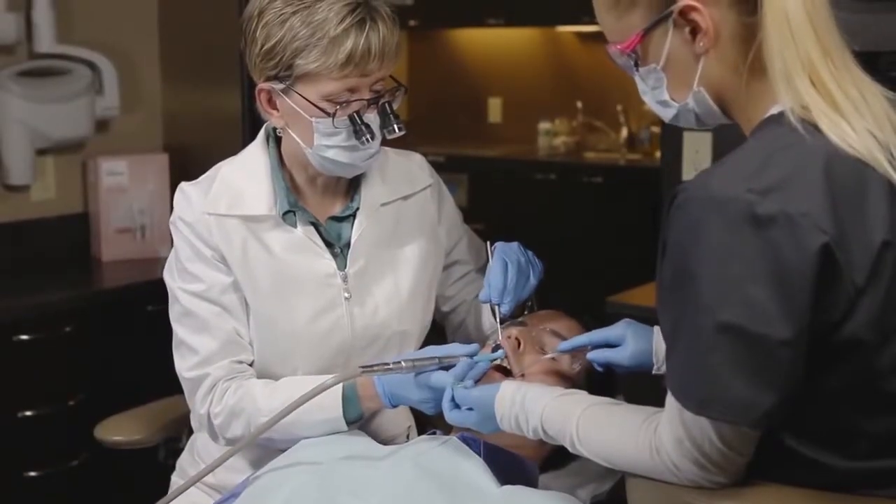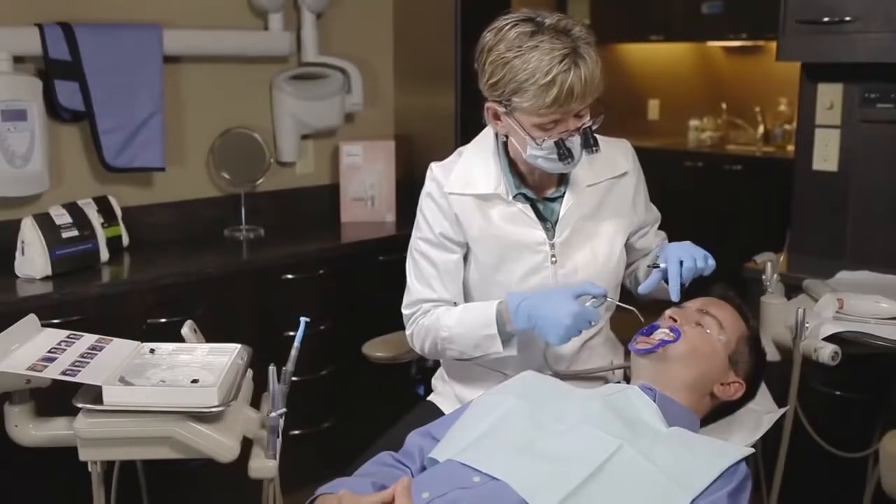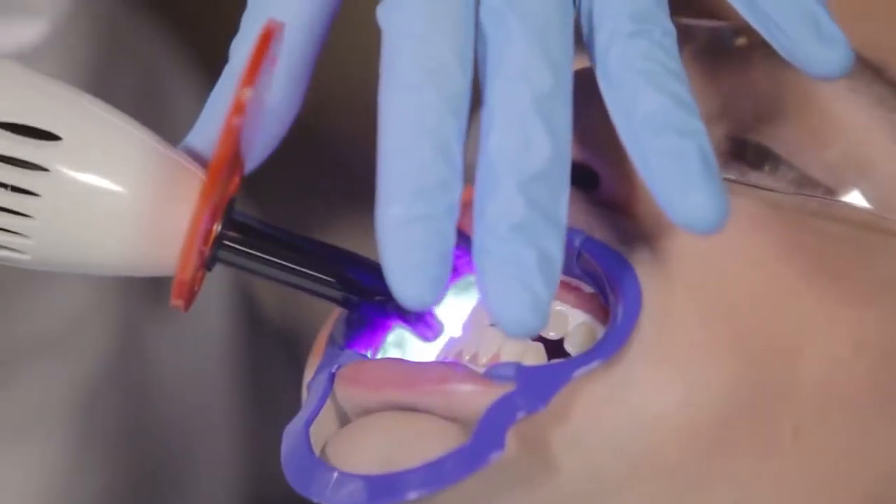Quick Pro can even be used prior to the application of a fluoride varnish. In this video, we'll walk through the Quick Pro application so you can incorporate Quick Pro into your practice.